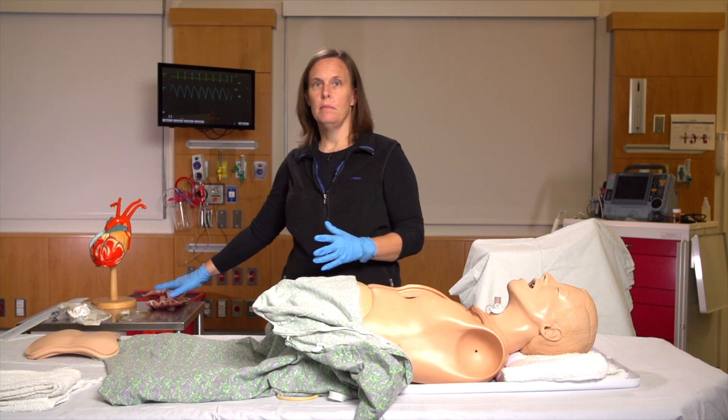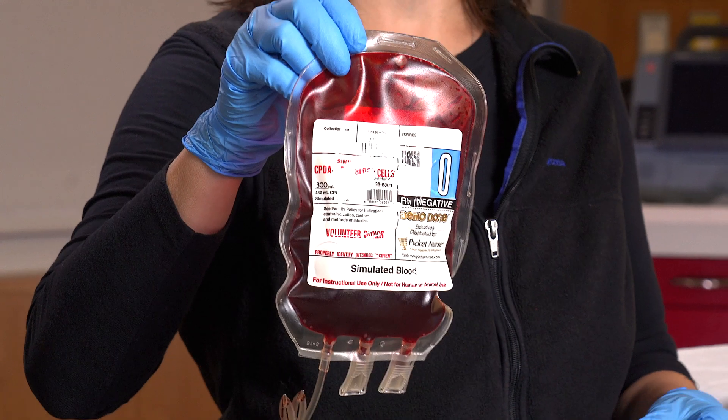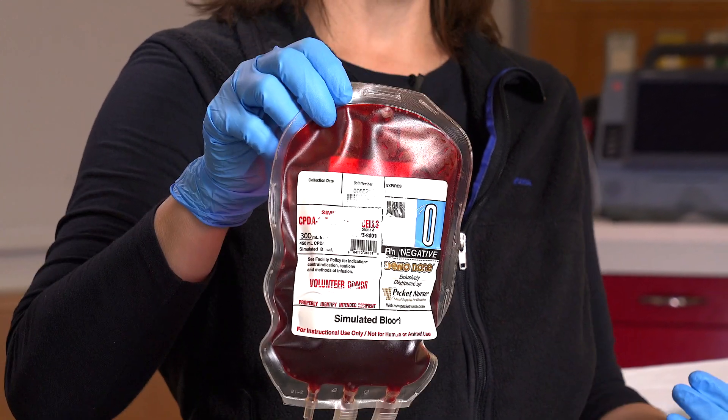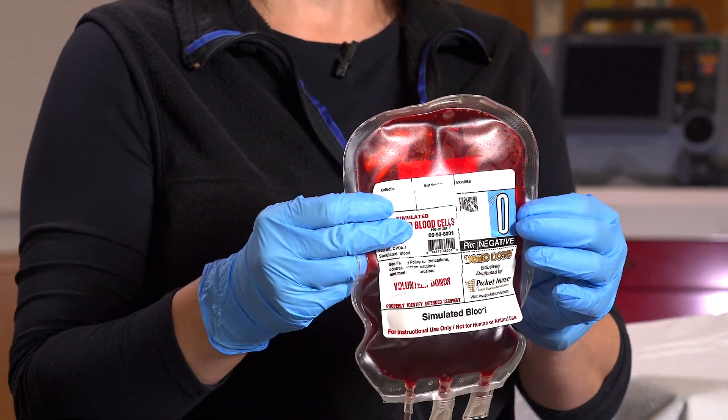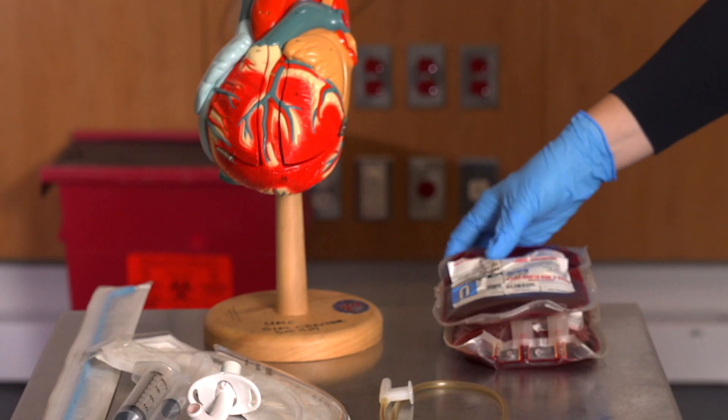We also had some fake blood for when the learner needs to order an emergent blood transfusion when the blood pressure is dropping and the patient continues to bleed. It helps to have some of those supplies as they're going through the case.